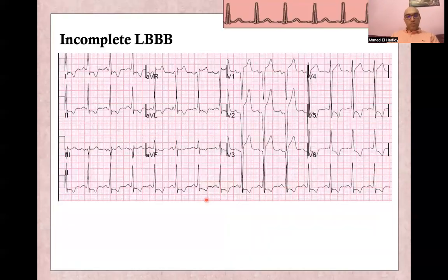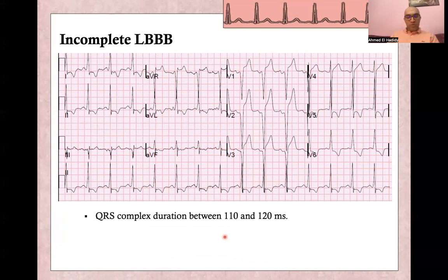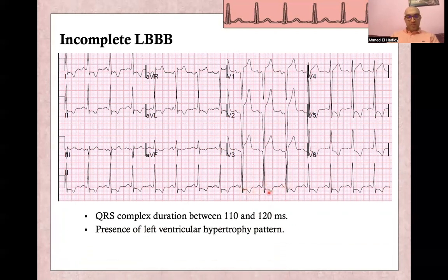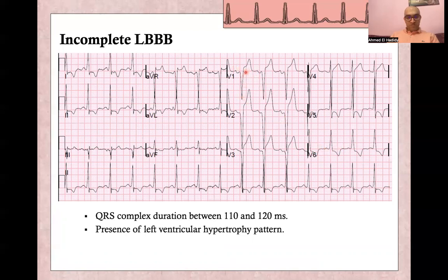Incomplete left bundle branch block has almost all criteria of left bundle branch block, but the QRS complex is not wide — it is between 110 and 120 milliseconds. This is why it is called incomplete. The other criteria are still present: no small Q wave in V6, deep QS in V1. It may also be associated with LVH voltage criteria for left ventricular hypertrophy, as seen in AVL, V5, V2, and V1.